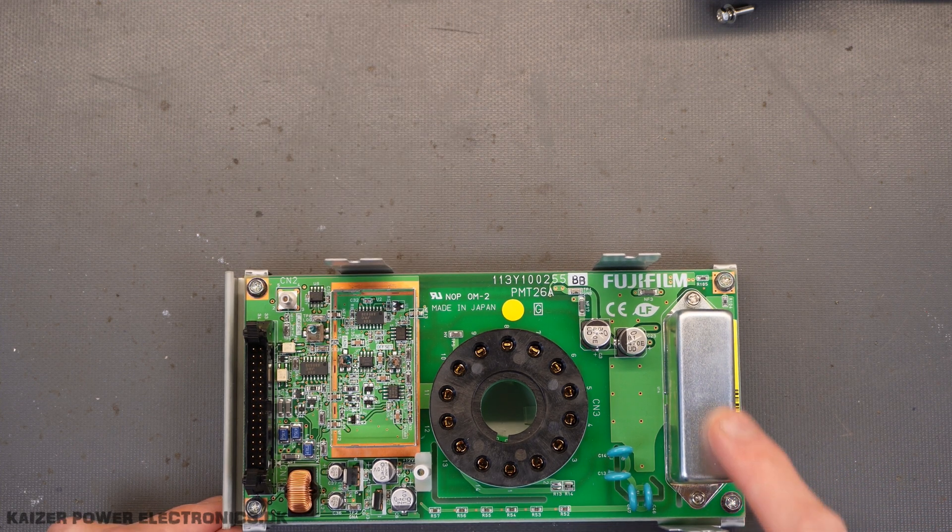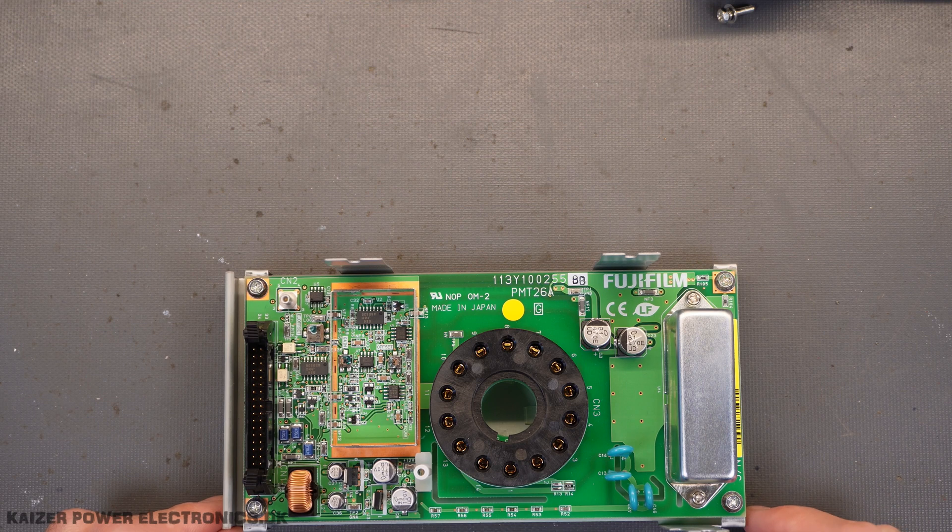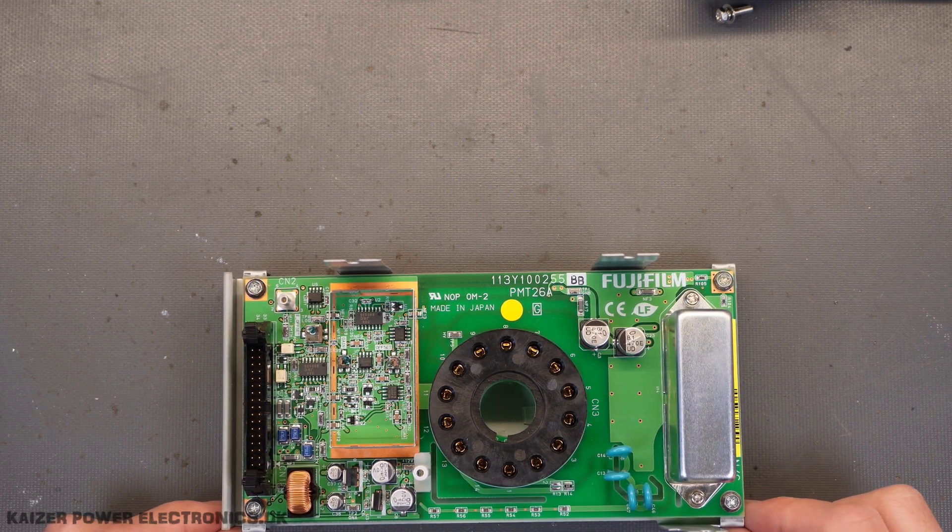The high voltage power supply module is changed to another one, which is from a company called Yi, so not exactly a Hamamatsu that were suited up for the tube itself.